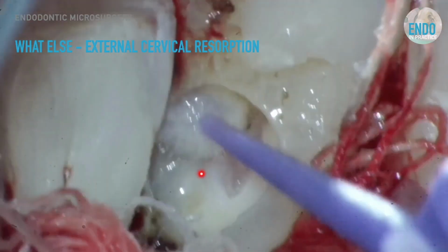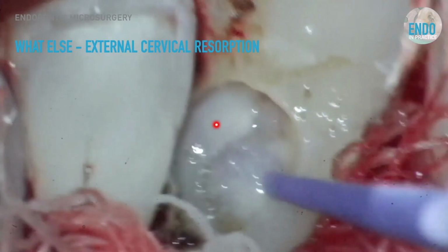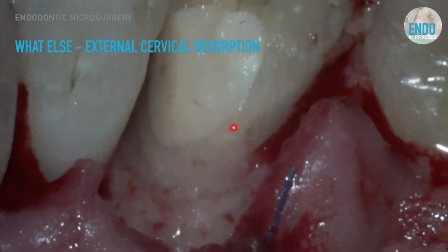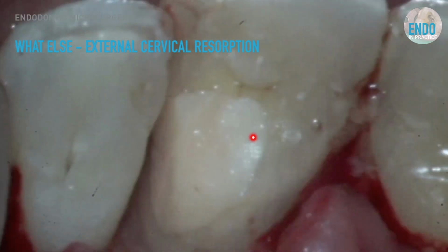What I'm doing is trying to chemically disinfect the area, because there are lots of little multinucleated giant cells and clastic cells in there nibbling away at that dentine. So I need to disinfect it properly, and then you put on a restoration and suture the gingiva back.